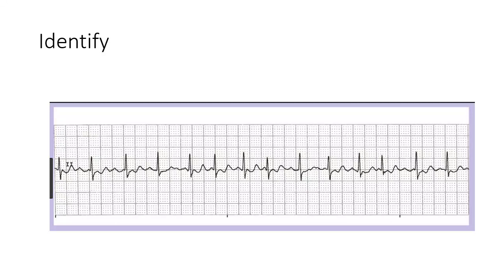So now, tachycardias that have variable PR intervals. What do you think? I don't know. Okay, somebody help him out. I would say MAT. All right. Why is it MAT, Tanner? So it's tachycardic, which makes up for the tachycardic part of the name. And multifocal. It's coming from a lot of different spots. So it's a P wave coming from everywhere that's really fast.